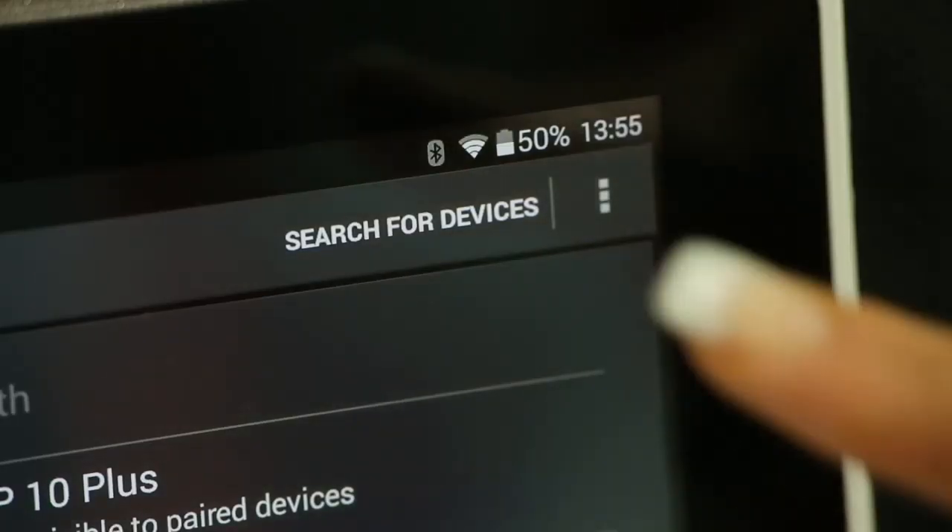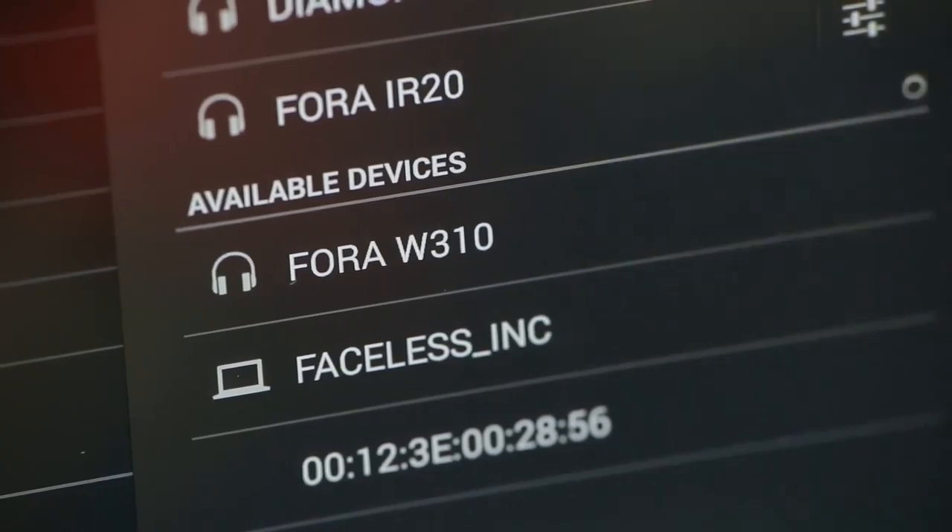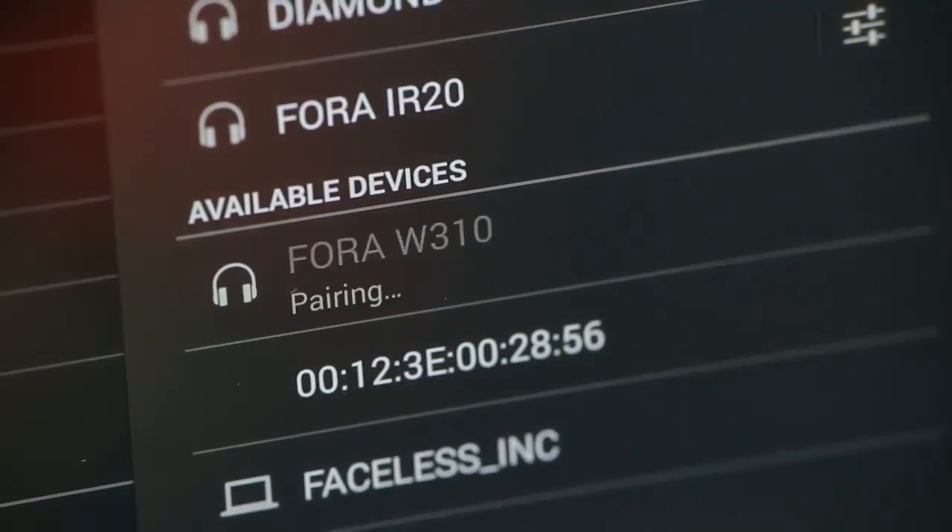Turn on your Bluetooth and scan for new devices. Look for Fora W310 in the Bluetooth search list. Tap on Pair.